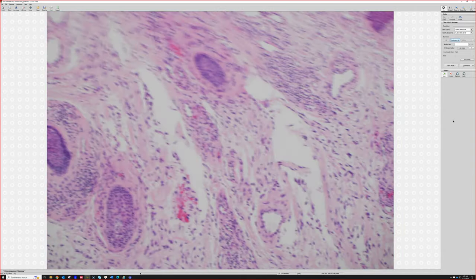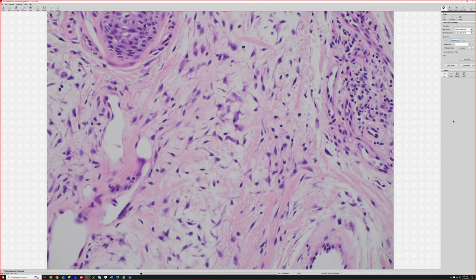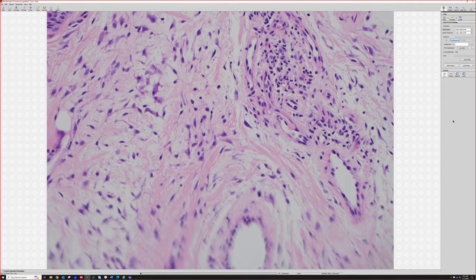But here we've got the dilated vessels. There is dense collagen. This one also has a bit of edema. I suspect that's because it's so pedunculated that there's probably some impingement on the lymphatic drainage, and it's getting some backed up lymphatic drainage with a little bit of localized lymphedema-like change in the midst of the angiofibroma. You can see a similar thing in large acrocordon skin tags, where they get kind of twisted on their stalk and they start getting a variety of reactive changes, including edema and dilated lymphatics, because the lymphatic flow is compromised by the thin stalk.